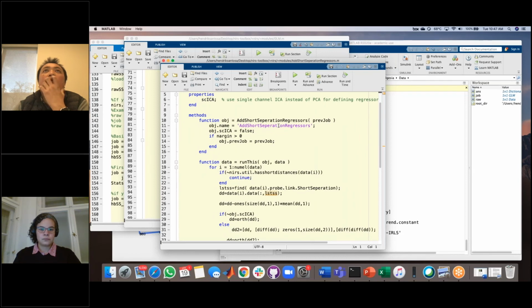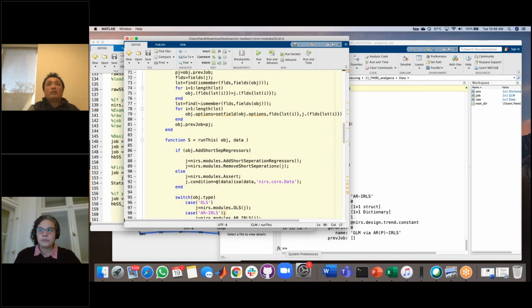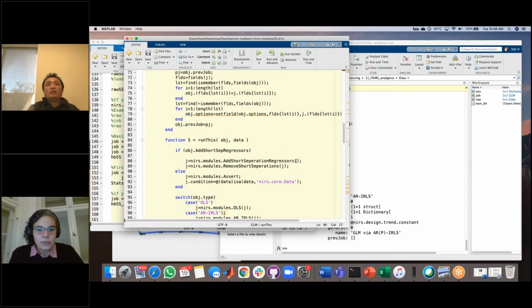By default it is true. Last time I think I just did it manually. If you want to use only oxy or only deoxy, there's no option in here.